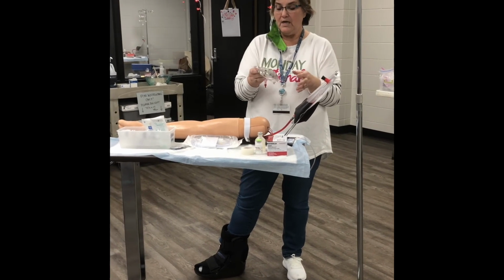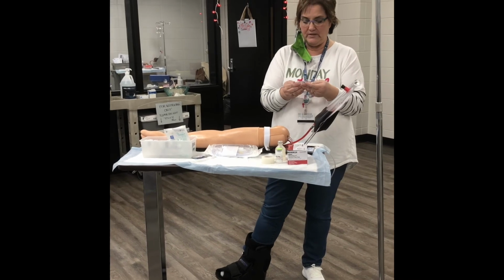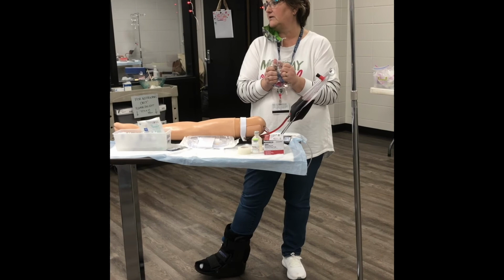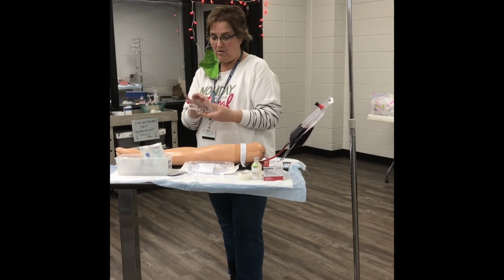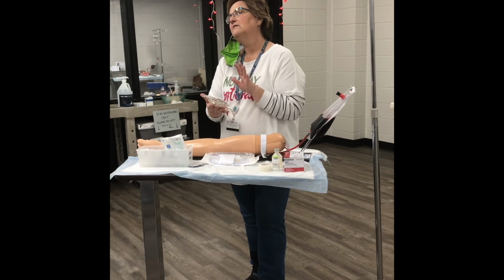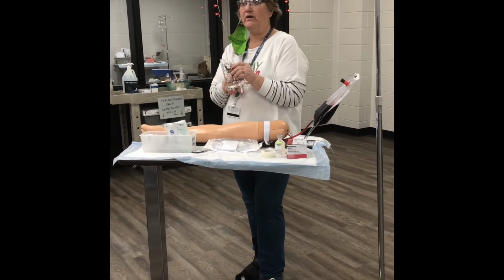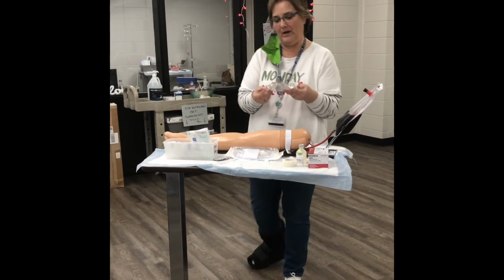That's what's ordered. What else do I have to check? Date. Expiration date. Don't be surprised when you get in your competency if your fluid is expired, because we get donated fluids all the time to help us not have to buy them all. But usually it's in one of the 4 corners. If it is expired, you can just say, this says it expires in 2012, but I'm going to pretend it's not expired. They know. I mean, they're completely aware.